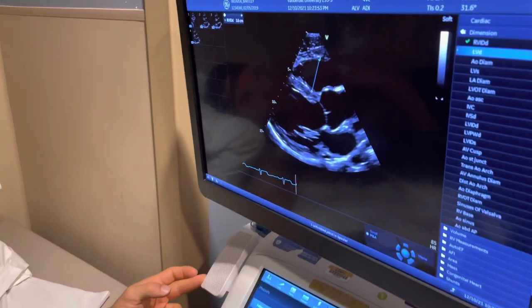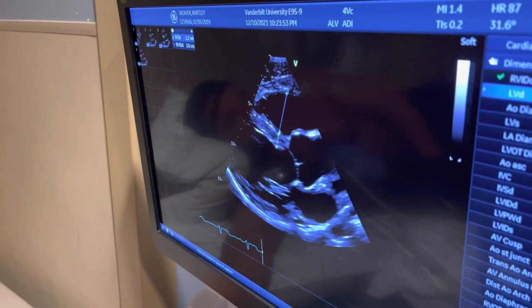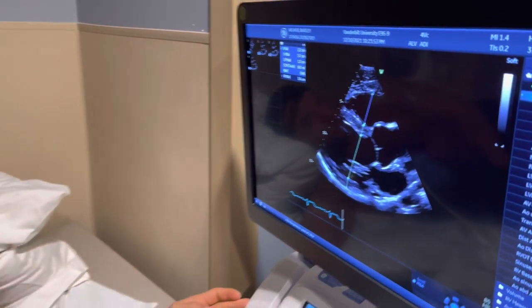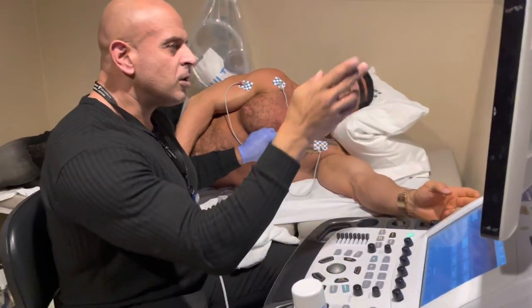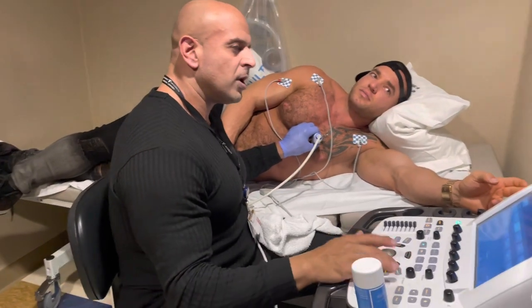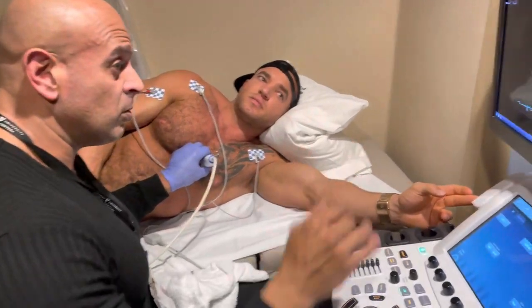I'm going to measure this chamber — that's the right ventricle. Is the left ventricle what's enlarged in athletes? With you it's in a normal range. Your function looks very good.